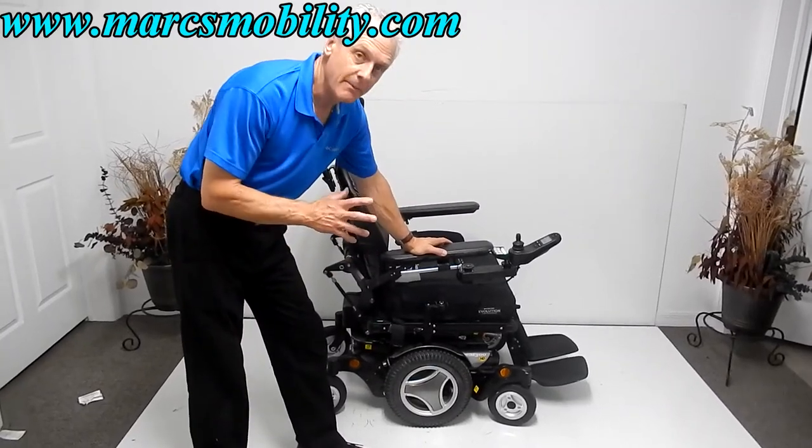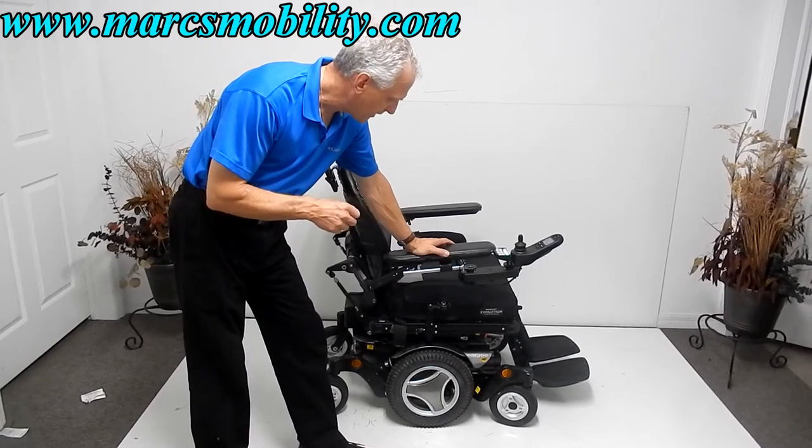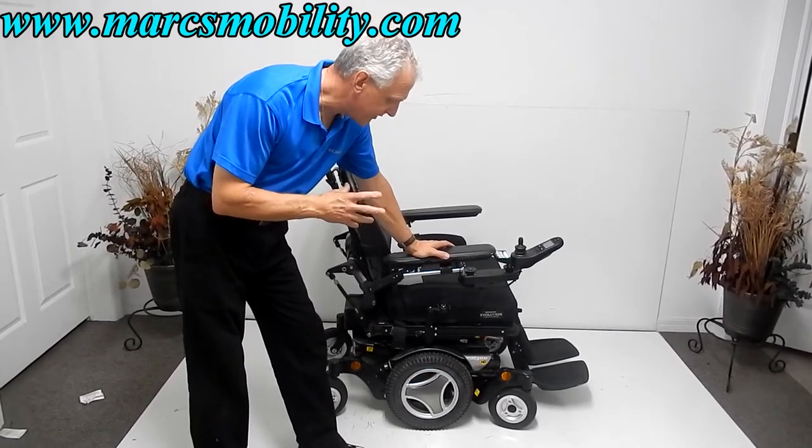This is a Permobil M300HD. The HD stands for heavy duty. It has a 450 pound weight capability, making this a heavy duty power chair.